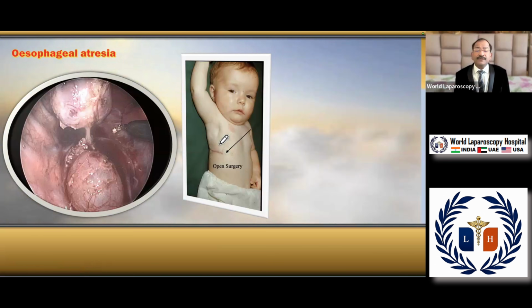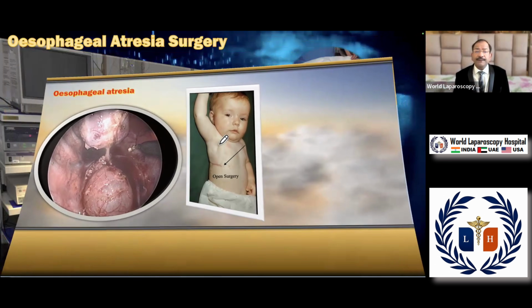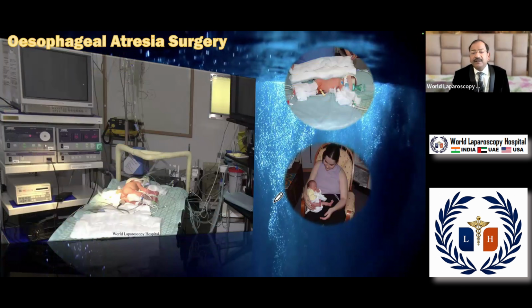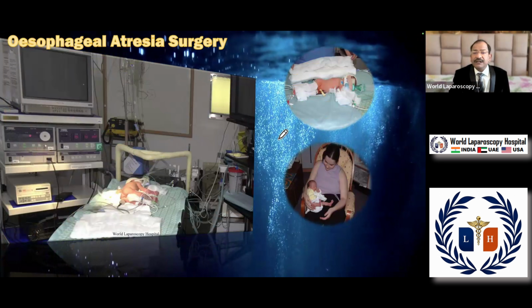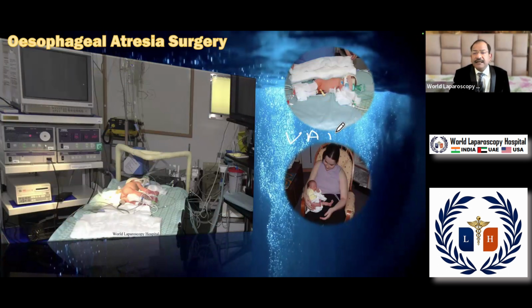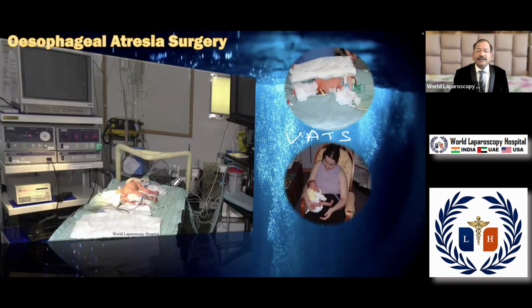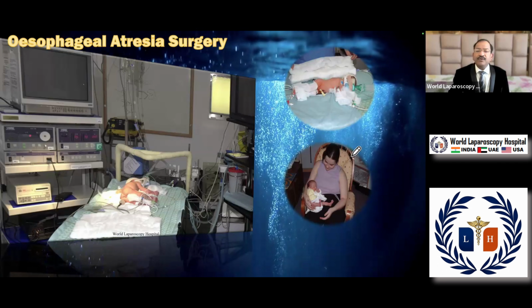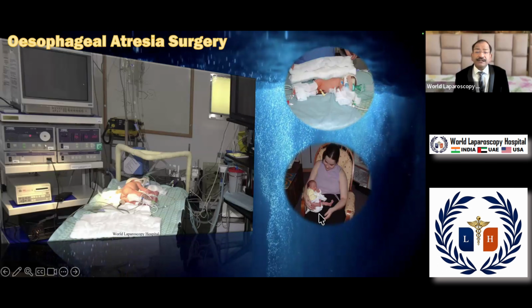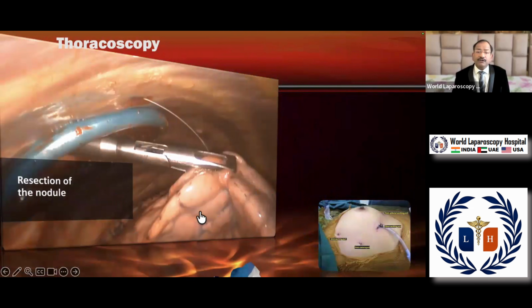But by thoracoscopy, even a 1 week old infant you can operate on by video assisted thoracic surgery, that is called VATS. And you can see here that the surgery was performed, and after 2 days the baby is in the lap of the mother. So, these pediatric surgeries are very popular.